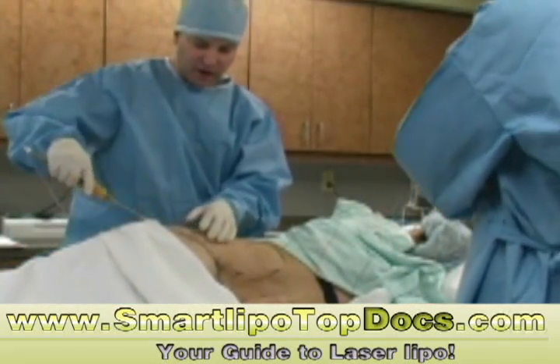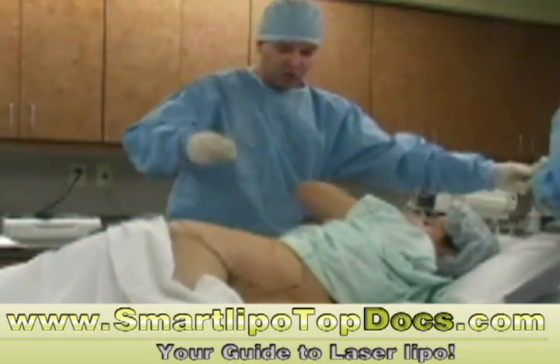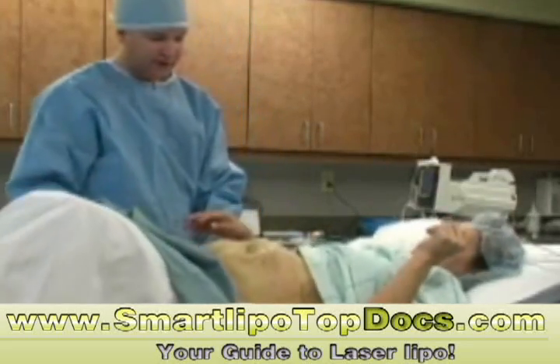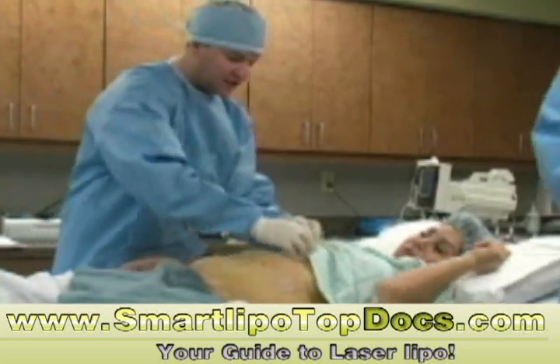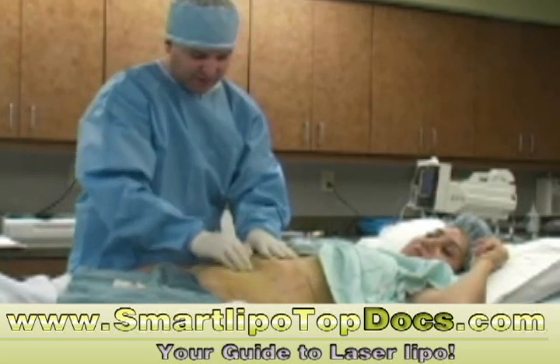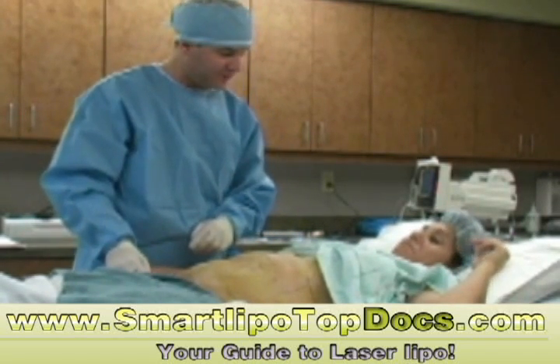Yolanda, we are done with the anesthesia process. I'm going to have you roll back onto your back. Just relax for the next ten minutes. We're going to let that anesthesia get all set up. Things are pretty much numb right now, but we'll give it a little extra time. And then we'll come back in and we'll start the fun part — taking out the fat.